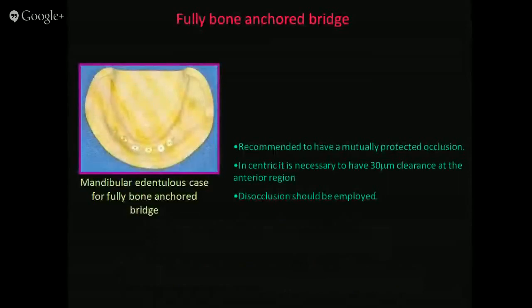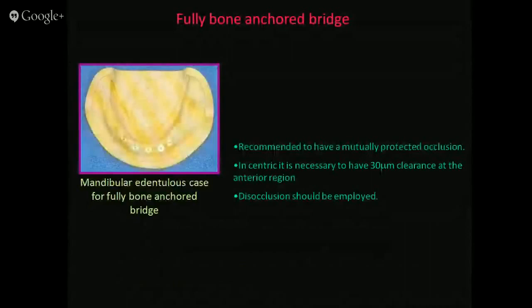Coming to the troubleshooting and the clinical applications of this occlusal scheme for implant restorations. If it's a fully anchored bridge, we have to understand that we need to have a mutually protected occlusion. Why?